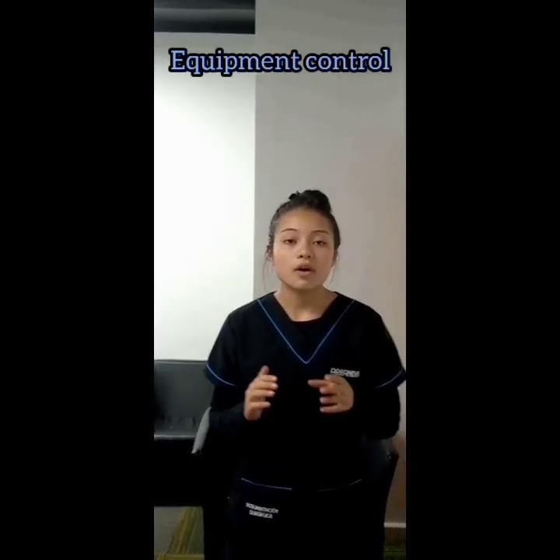In the control of the equipment, the steam sterilizer must be checked daily to verify proper air extraction and steam penetration. A method such as the Bowie-Dick test is performed. This is done with the chamber completely empty. 1. It checks the vacuum level, detects air leaks, and measures the level of steam penetration. 2.